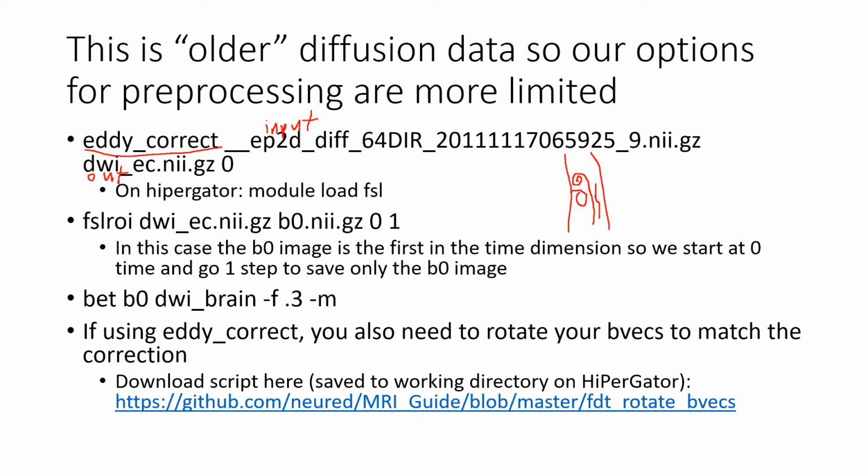Every time we're looking at the brain, we're looking at one slice at a time, but this acquires the whole brain, and then you get that picture 65 times. So it's kind of a functional acquisition, but it's used as a structural acquisition. Diffusion imaging, you're looking at structure, but we acquire multiple directions, so again it's kind of like a functional scan.